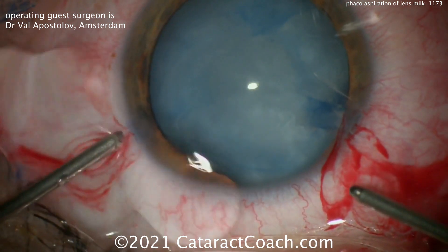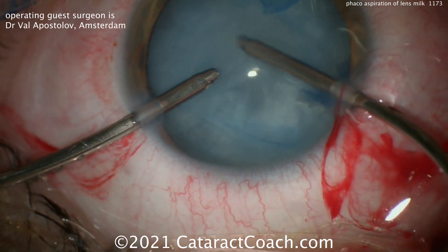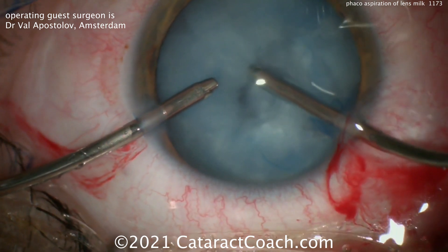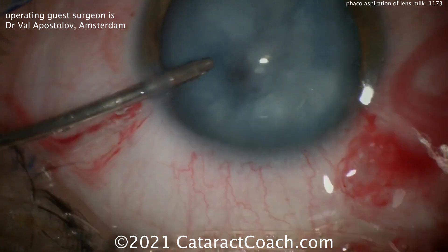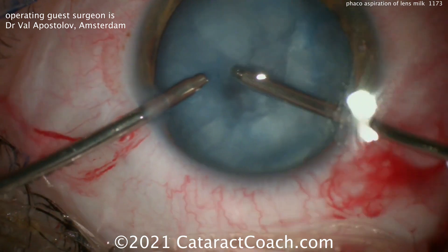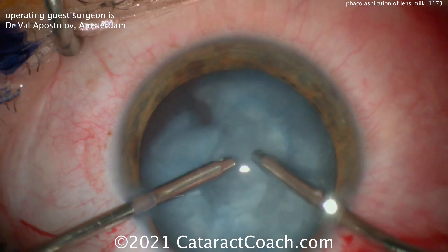Going in now with bimanual larger-gauge irrigation and aspiration, simply aspirating out that lens material. This cataract is not a dense white cataract — it's a soft, fluffy intumescent white cataract — so all that material is going to be removed very easily. We've shown all these techniques before, but it helps to repeat and review them, especially for newer viewers.